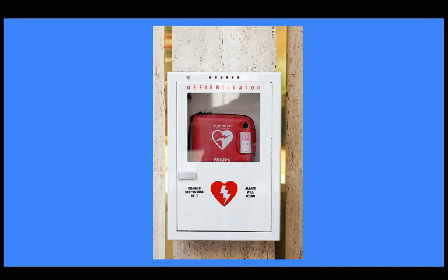In a witnessed cardiac arrest where the person is observed to suddenly collapse, the most common cause is likely to be VFib, and a defibrillator should analyze the person as soon as possible. Using the team concept, one rescuer should coordinate all available rescuers so that one rescuer performs chest compressions while the second rescuer prepares the AED for use. Although there are many different brands of AEDs, all are utilized in a similar way.